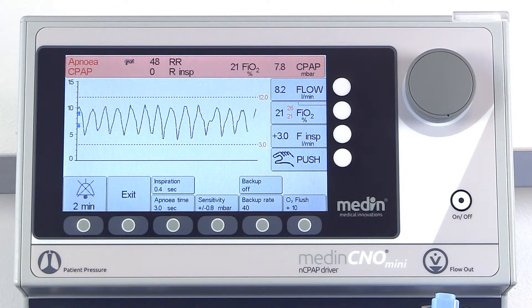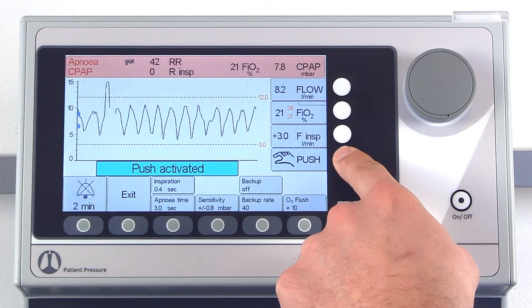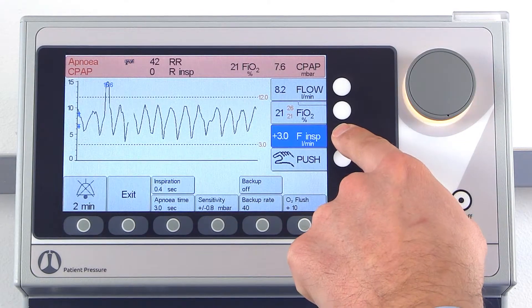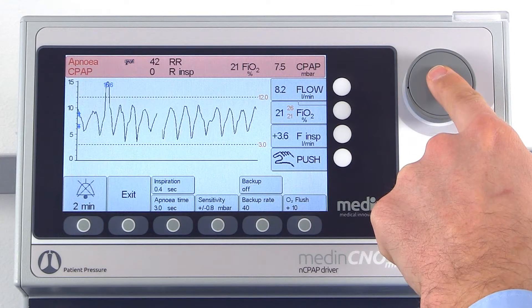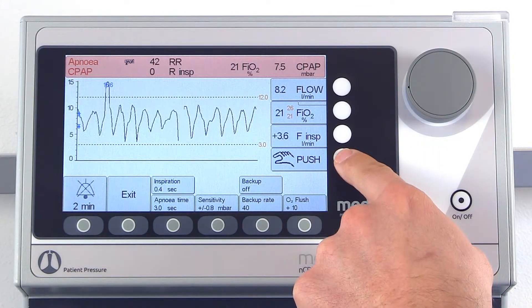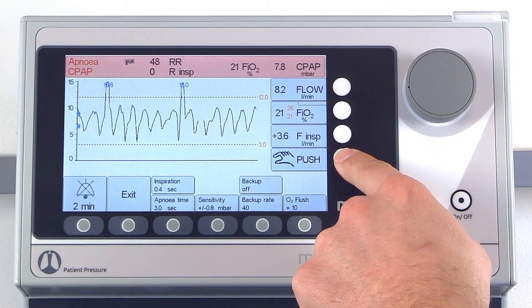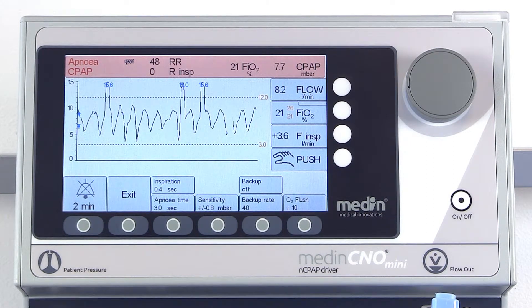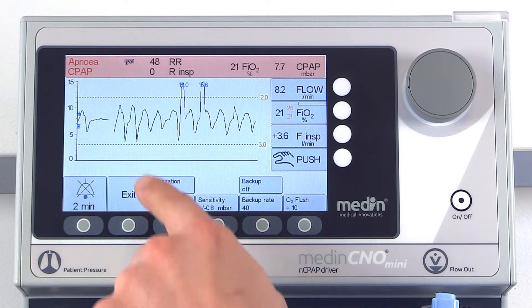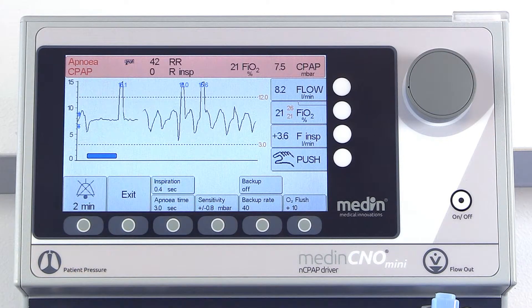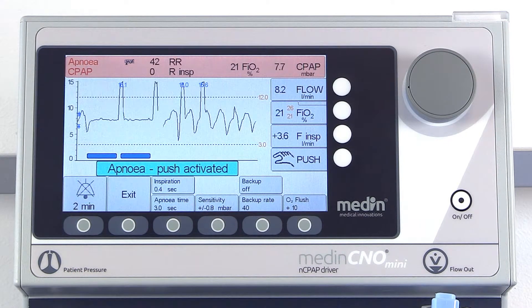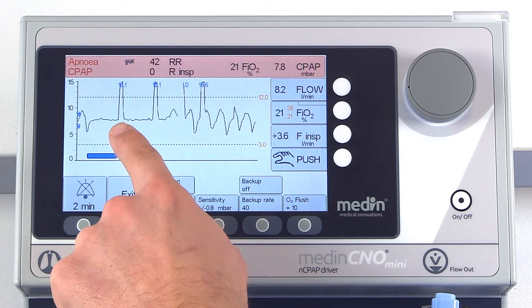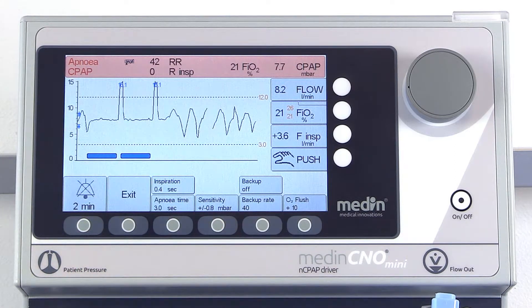The Medin C&O Mini is also able to apply additional push flows, which you can adjust if necessary. In the case of apnea, which is indicated by a blue bar, the Medin C&O Mini either applies a single push flow according to the apnea time or an optional backup rate.